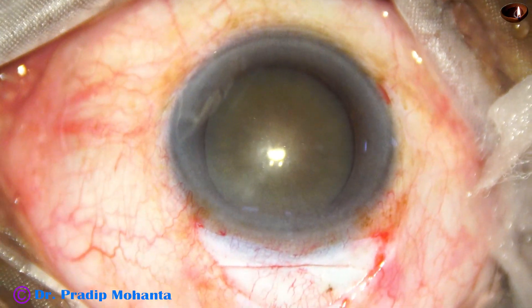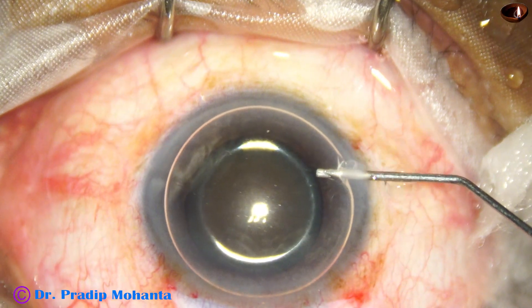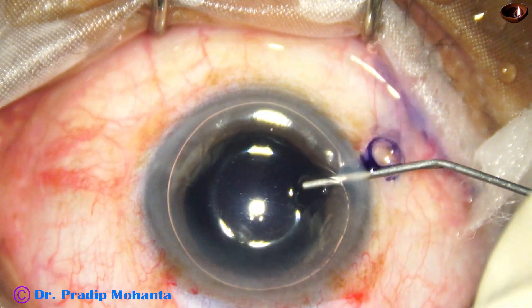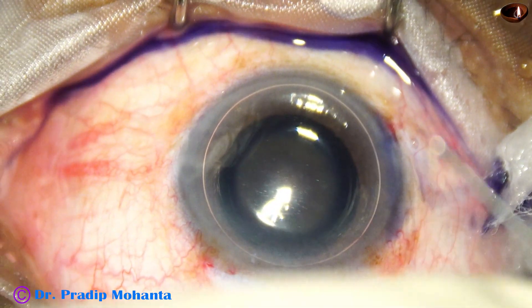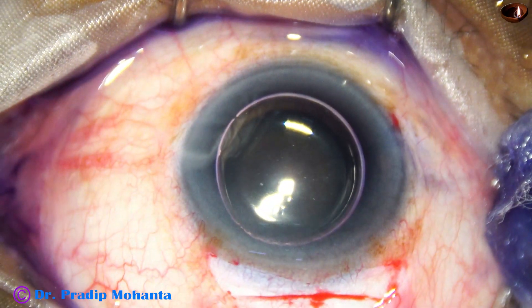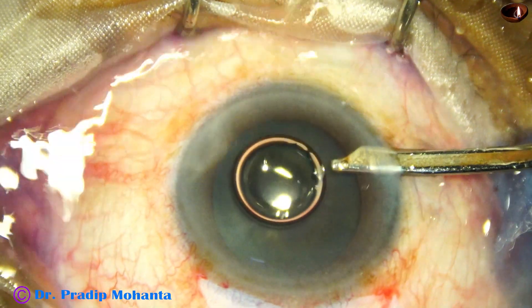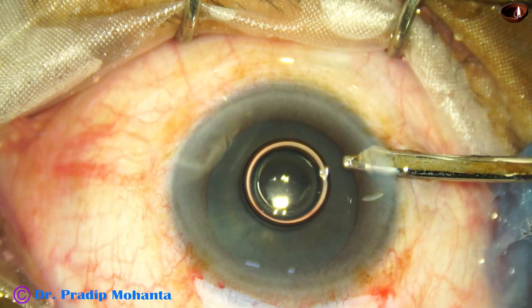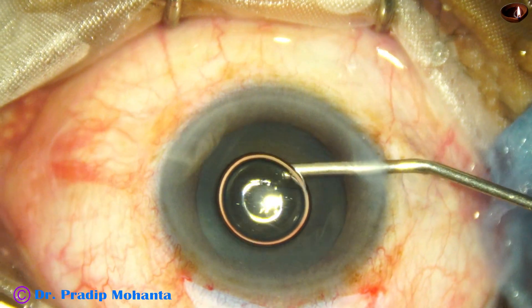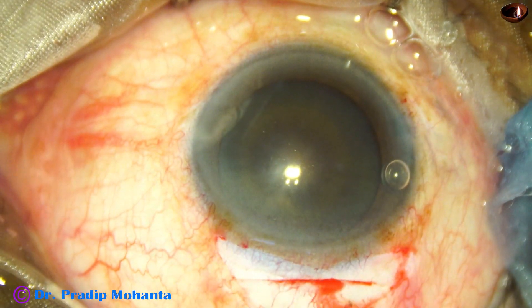This is a side port on the right side of the main incision at about 9 o'clock or 8:45, and an air bubble is injected to fill the anterior chamber. Trypan blue dye is then applied over the ocular surface, followed by a bit of adrenaline, and then the dye is washed out. This is a 23-gauge Simcoe cannula. Now the anterior chamber is filled up with viscoelastic substance — this is 2% hydroxypropyl methylcellulose.